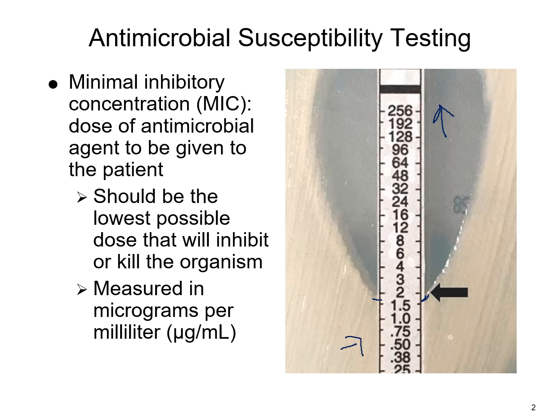If we're trying to figure out exactly what our minimum inhibitory concentration is, then we need to round up, because we're somewhere around 1.5, give or take. It's closer to the 2, so we'd round up to 2 micrograms per milliliter. That would be the result that we report out as the lowest concentration of that antibiotic that could be used.